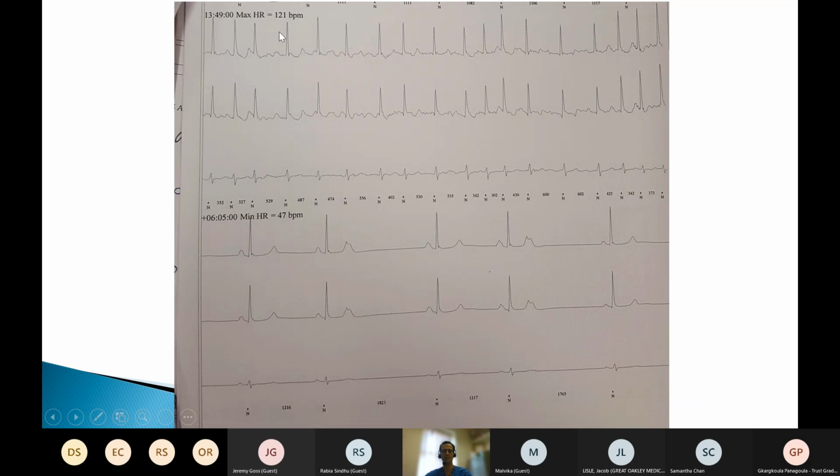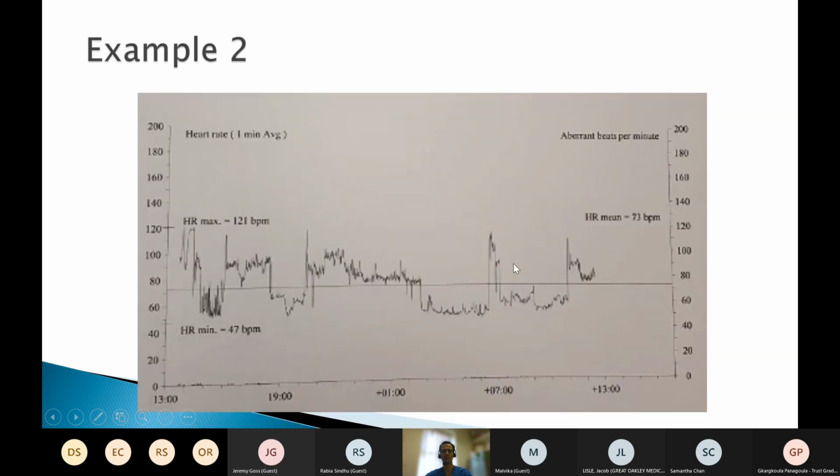But the fact that they've got some fast atrial fibrillation rate of 120 and they've got some bradycardias, we're going to have a job controlling the faster rates without making these slower rates go down too much. So what we do here has to depend very much on the patient's symptoms. If the patient is symptomatic, then we would have to think about slowing them down with a bit of beta blocker, and that's likely to wind up with the patient needing a pacemaker.